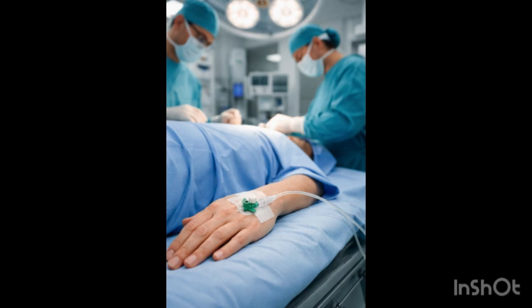So next, the most important thing, you need to identify a good vein. For that, you can use the tourniquet method. When you are applying the tourniquet, the pressure should be more than venous pressure but less than arterial pressure, not too tight. And you can ask the patient to open and close his hand. By doing that, it will increase the venous flow to the hand. An old method was to tap or rub the vein, but it can hurt the patient, so it's up to you.